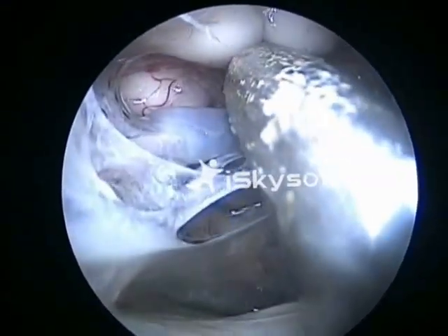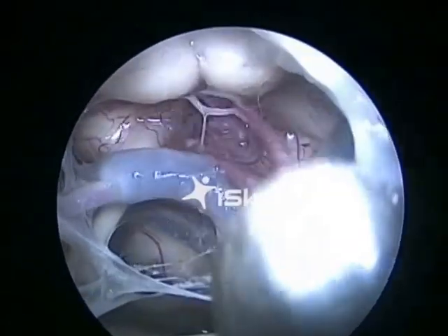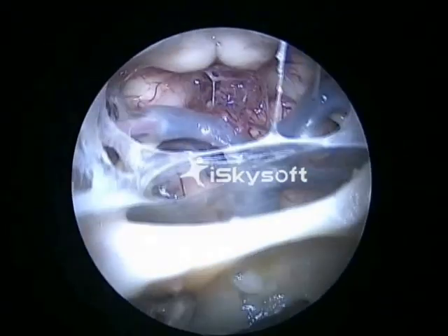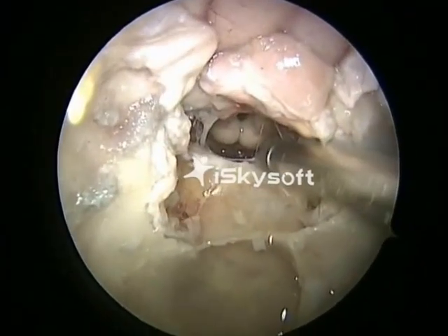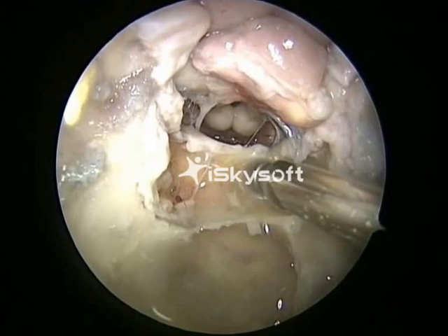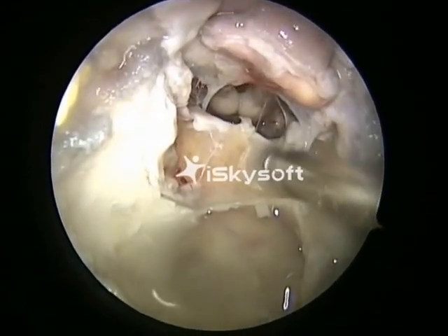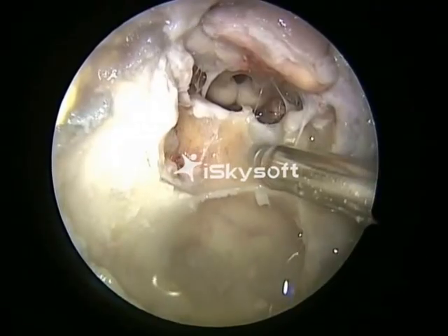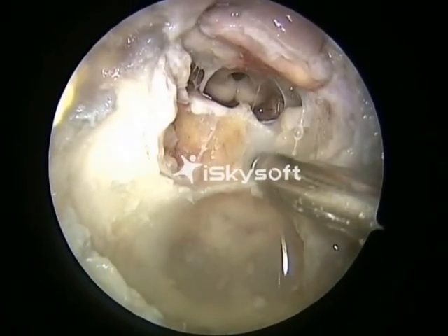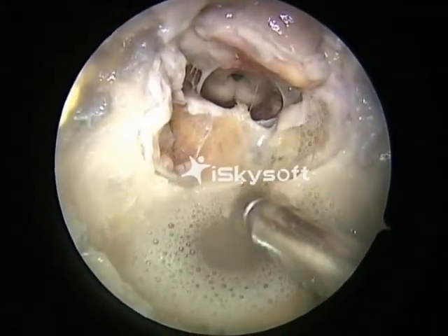That's the posterior cerebral. The ventral part of the upper clivus is bounded by the dorsum sellae and the posterior clinoid laterally. That's the dorsum sellae being dissected out. This is the approach to the upper clivus. We make two shoulder osteotomies using a diamond burr, so that we separate the posterior clinoid process from the dorsum sellae.